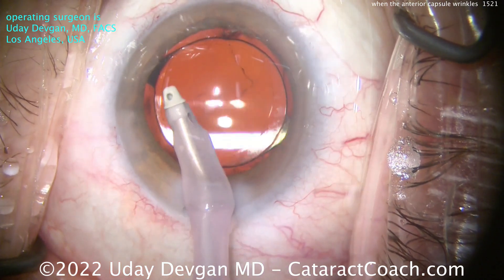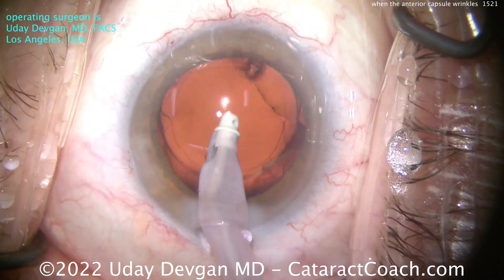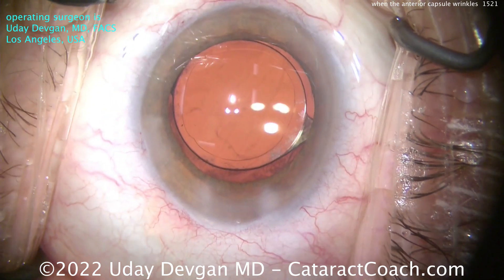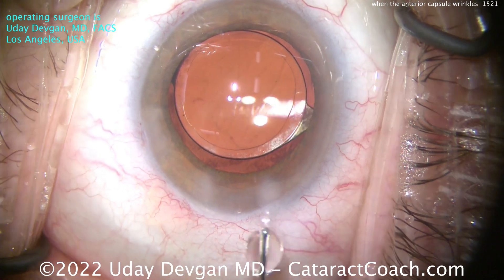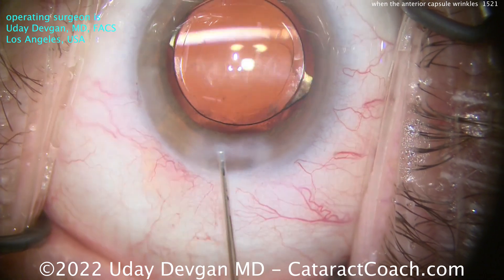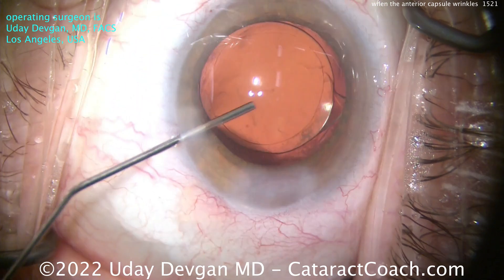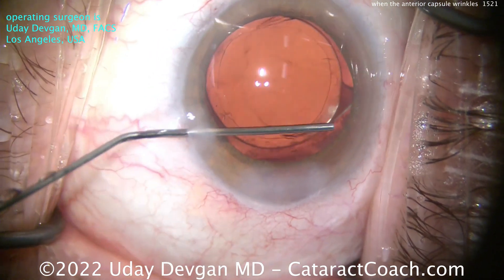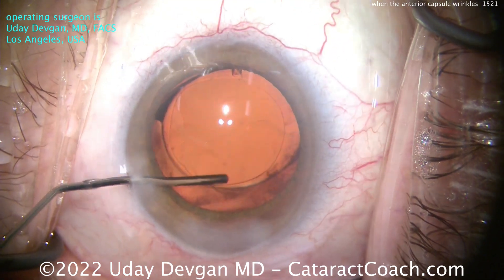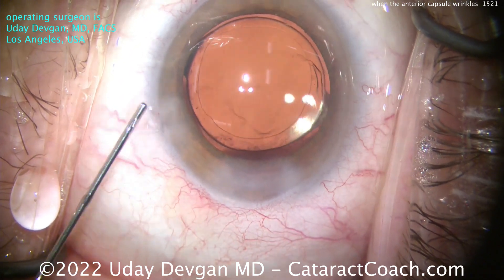This is looking like a pretty good case. You can do a little more polishing of the undersurface of the anterior capsular rim if you wish, but I think we're looking pretty good. I just want to make sure there's no retained viscoelastic inside the eye — there's a very nice overlap and good-sized rhexis. Let's hydrate the incision — good architecture, look how long that tunnel length is. Going through the side port, let's do a little angle sweep. Wow — retained viscoelastic. I'm glad we did that. Get all that retained viscoelastic out; that would have caused an IOP spike on post-op day one. Clean that out and seal up the incision.